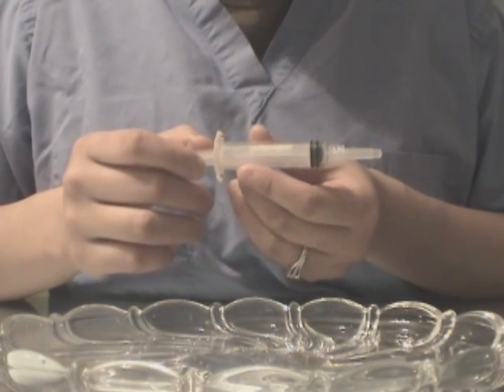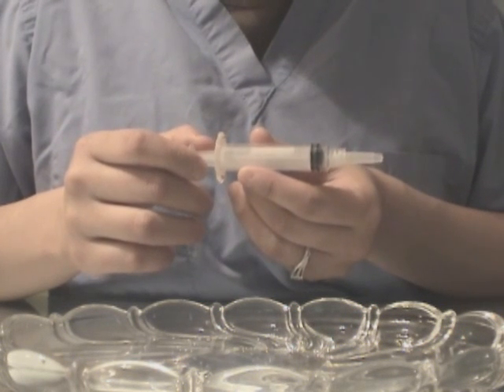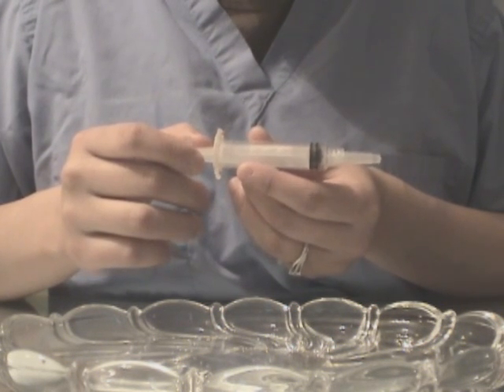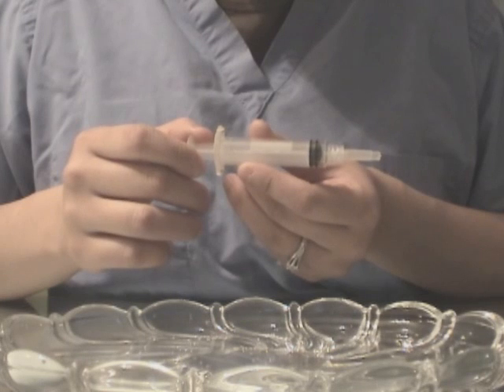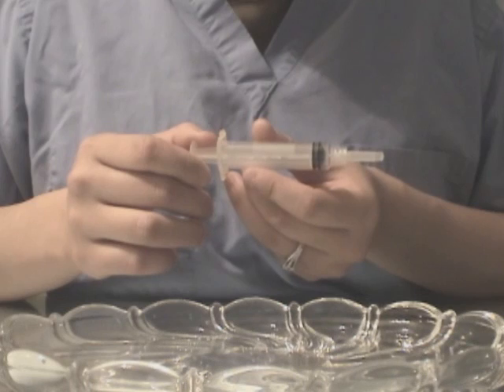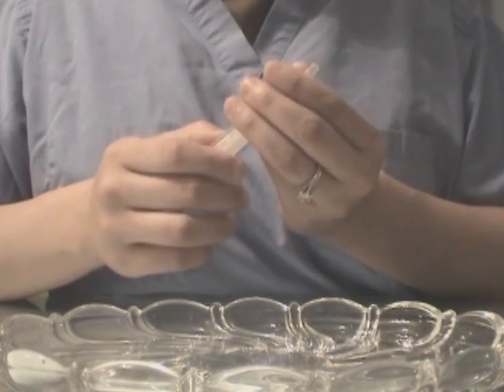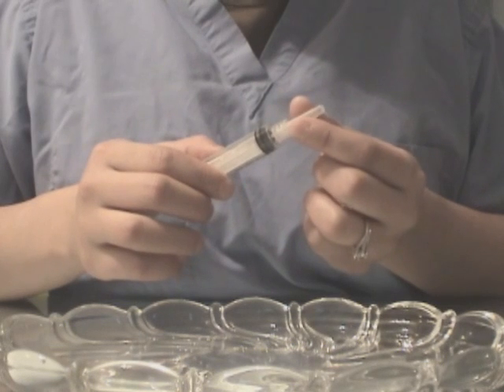you can also put it into a sharps container or bin in which the needle will also retract back into the compartment on its own. You will not have to hold on to the syringe. So, right now, you want to go ahead and remove the cap.